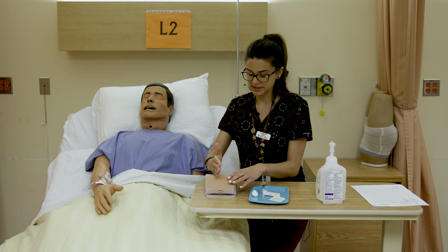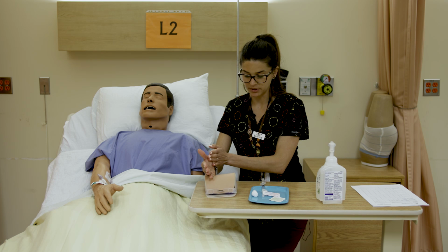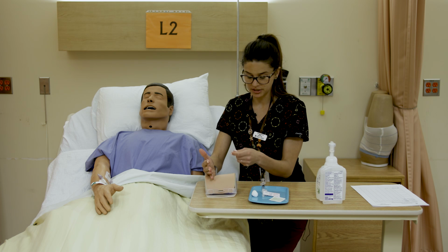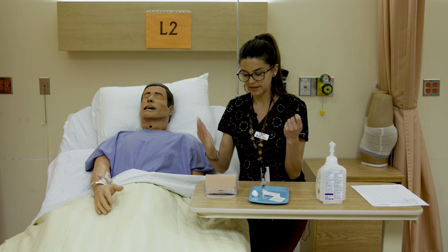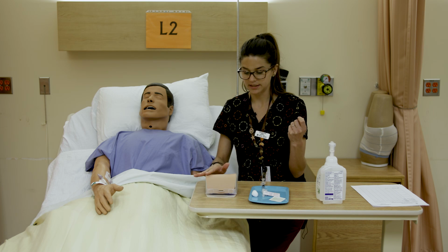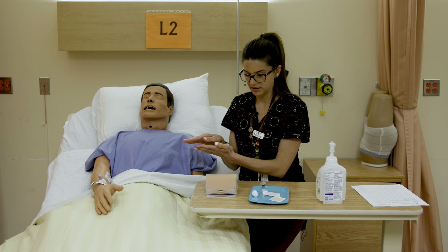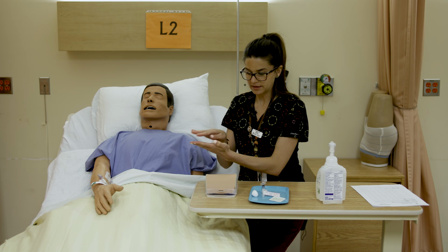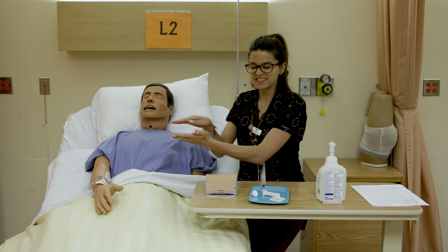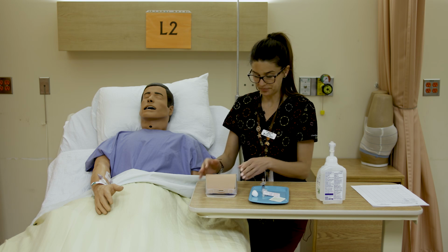And the reason for that is you pull it tight and you do your injection with the skin pulled taut to one side. Do your injection, you instill or depress the plunger, and then you remove it, and then you let go of that displaced tissue. So if you can sort of imagine underneath, and there are some good diagrams in your text that show this, that displacement of tissue actually kind of seals in the medication so it stays within the muscle.